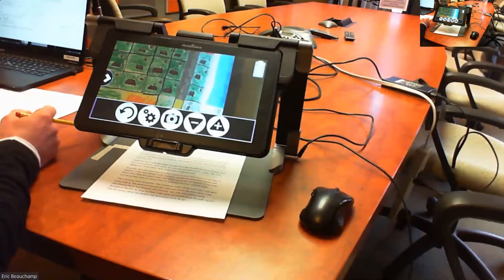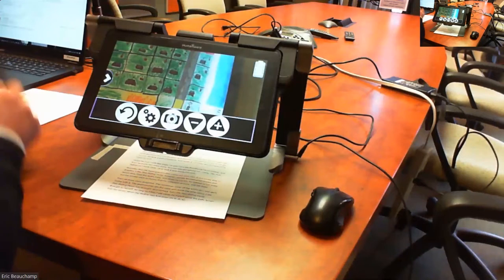So I have a couple of questions here. So try the poster on the left. So that's what I just did, and there you go. So you got some nice color here.